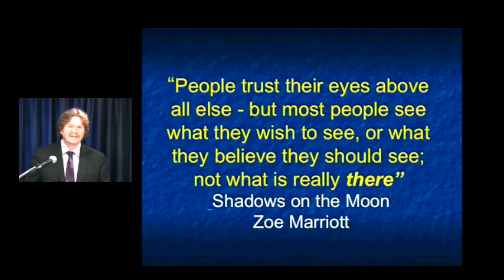And we've discussed this literally in every single talk we always give, whether it's pancreas, liver, kidneys, chest. Everything is based on technique. There's a good quote I saw: people trust their eyes above all else. Most people see what they wish to see or what they believe they should see, not what is really there. Well, as a radiologist, we know that would be a real problem. You need to see what is there.